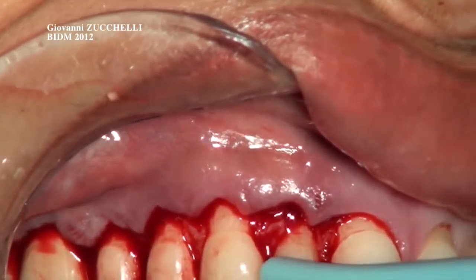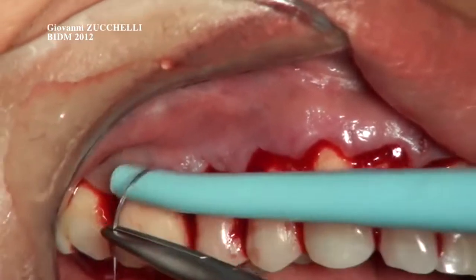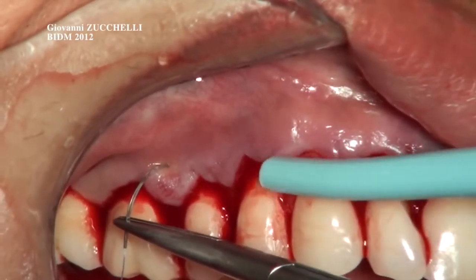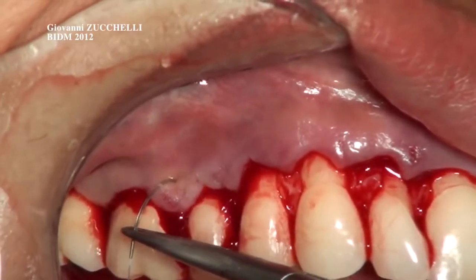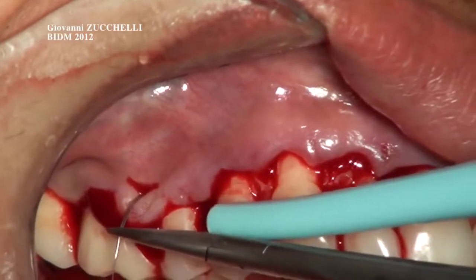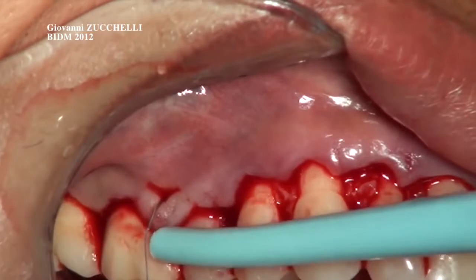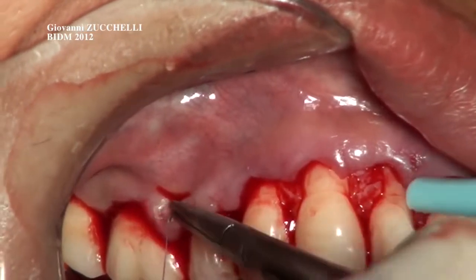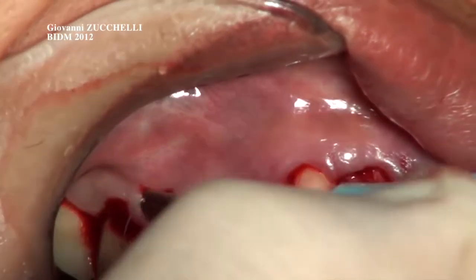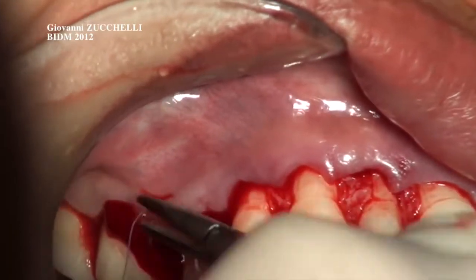You give it to me when I finish. Okay, now please suction here. You see that I take my needle in the middle portion of the surgical papilla. I use the needle in such a way to advance the papilla, suction here, in the right position, and at the same time make a perforation of the surgical and anatomic papilla so that I can get to the palatal aspect.